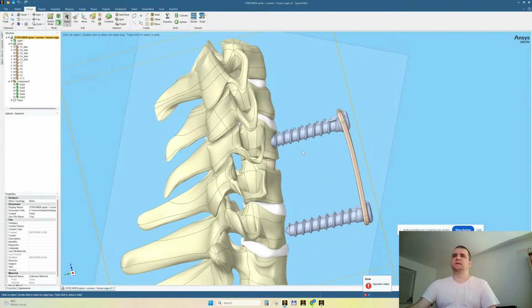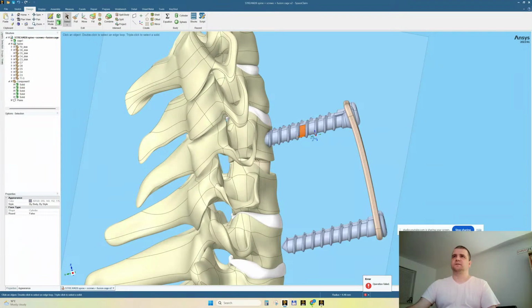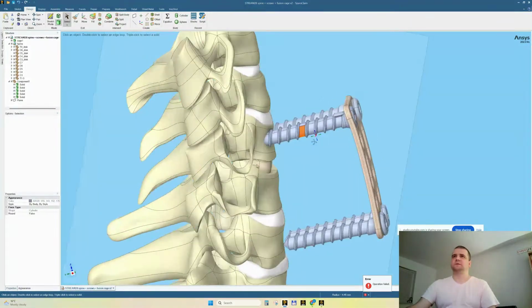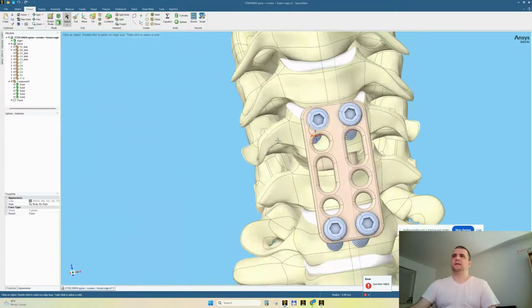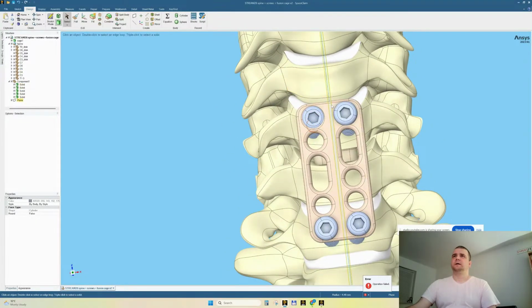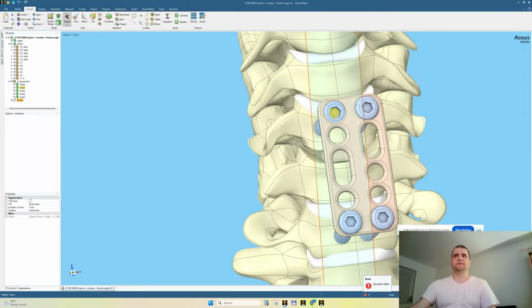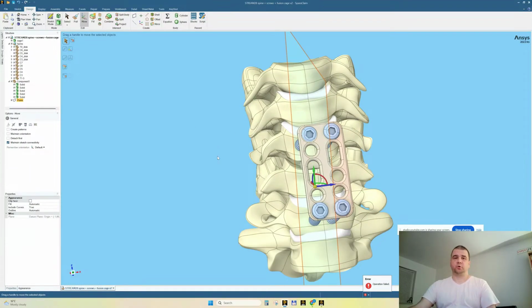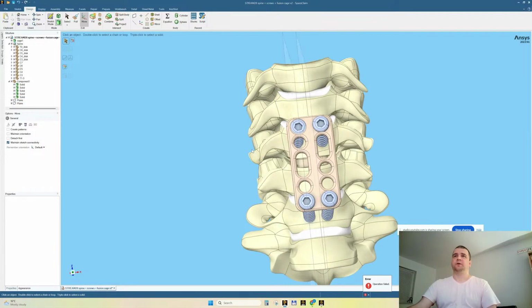All right. The screws are still chunky. The radius is so much. Because we have only 4 screws, I was wondering if I can scale them. Let me also move a section view between to see the screws and the plate. Yes, so I'm clicking the plane, click the move button, but because I would like to copy it, not move it, I'll press Control, and drag. I will drag this to pass through the screw, and now it's passing almost through the middle of the screw. Yes. Now to have a section view here, we click this plane, section.